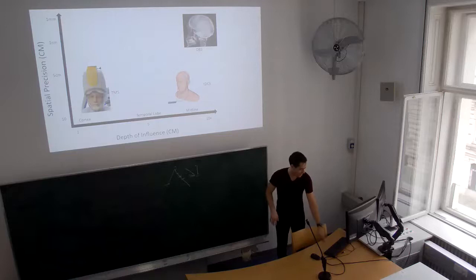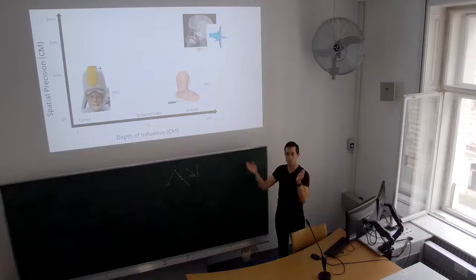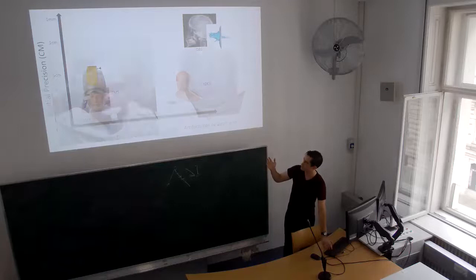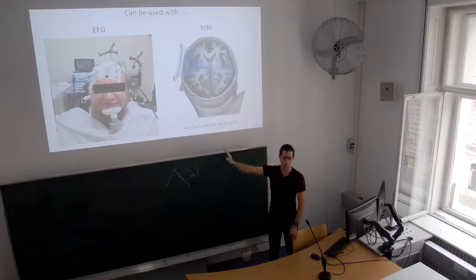So an answer could be this whole focused ultrasound thing, right? Because relatively speaking, it's much more precise than these techniques. Depending on how you do it, it gets close to the precision of DBS and it can be done non-invasively, focused anywhere in the brain, right? So think of all the potential there, all the deep subcortical nuclei that have never, ever been modulated in healthy people, okay? Now, just to note, it can be done in concert with EEG and MRI. There are some artifacts to be dealt with. I won't go into the details, but they can be dealt with.